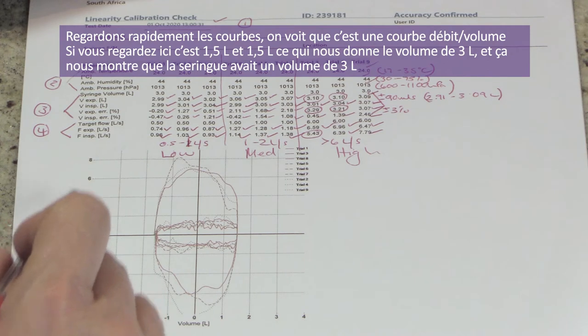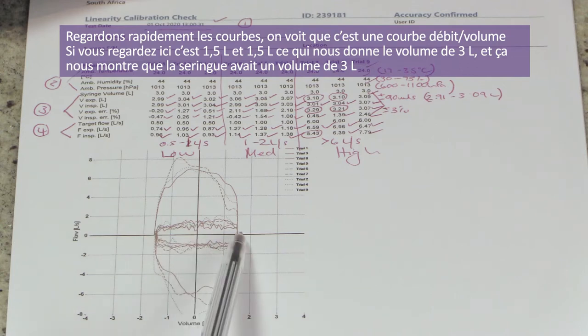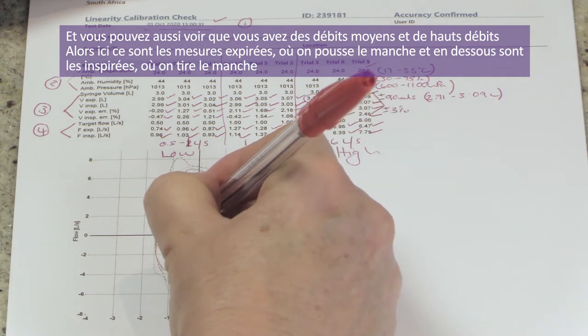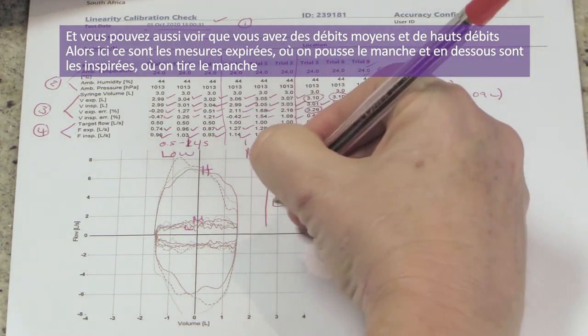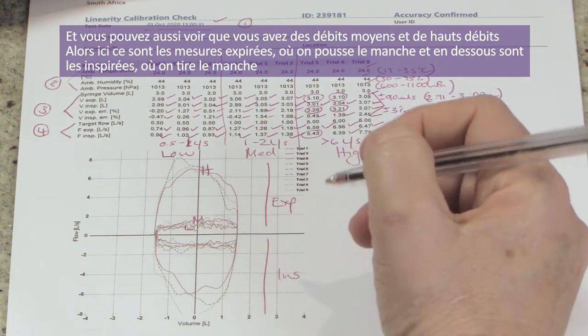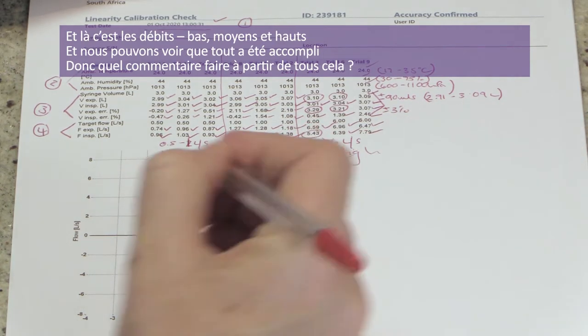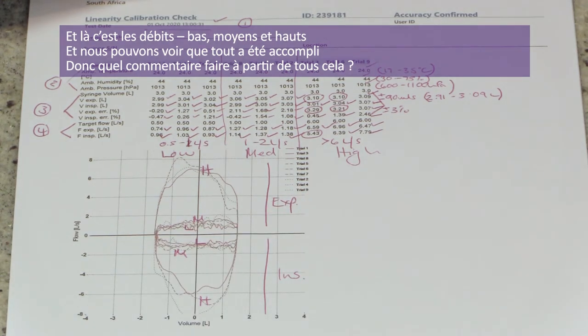Let's look at the graphs. This is a flow volume graph — volume shown as 1.5 liters each side, confirming a 3-liter syringe. You can see distinct low, medium, and high flow rates on both the expired side — that's pushing the syringe handle in — and the inspired side, which is pulling the syringe handle out.